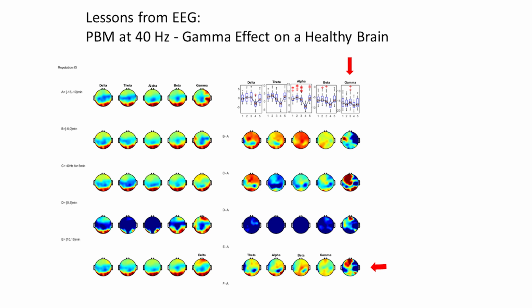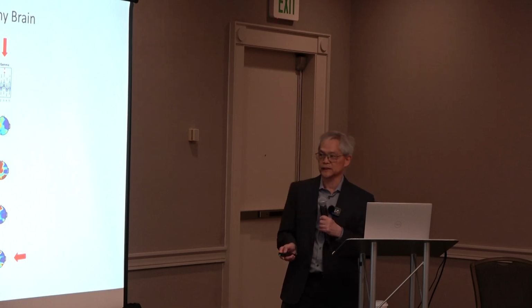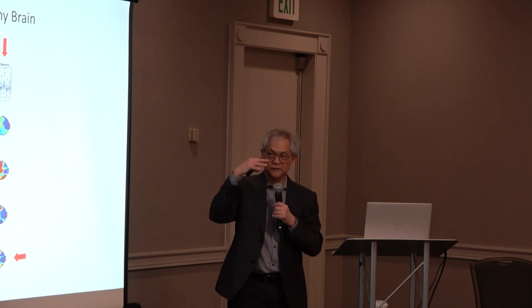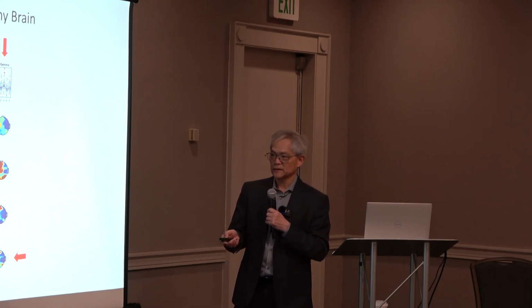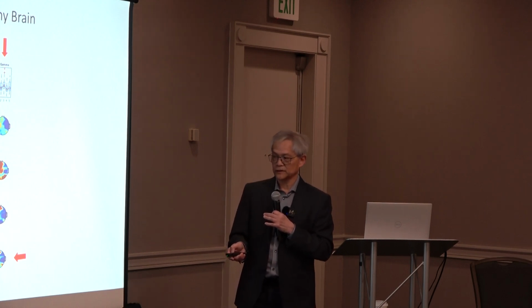And it's pretty consistent. So the first line is the baseline, and then pre-treatment, this is the treatment, and this is after treatment when you stop for, I believe, 5 minutes, and then post, was it 15 minutes later. So these are the net effect. So this minus baseline, just before the treatment, he had higher low frequencies and low gamma. But after real time, these are real time data, we actually measure the EEG while we're doing the intervention. His gamma has gone up. While 5 minutes is very interesting. After we stop, the other waveforms went down, but the gamma maintained. And then 15 minutes later, after we stop everything, the brain restored and the gamma keeps going up.